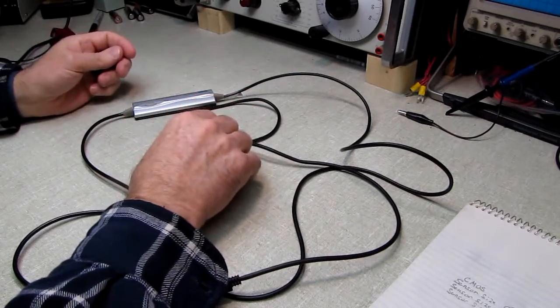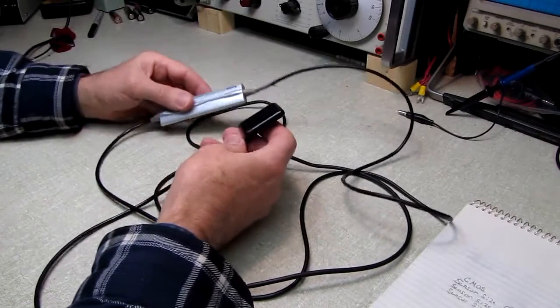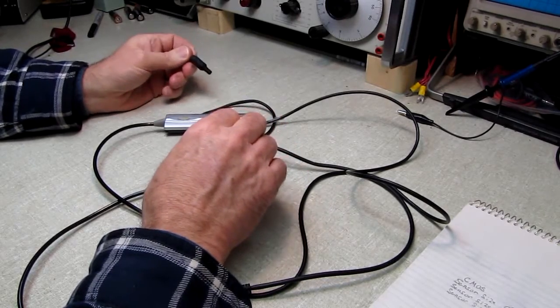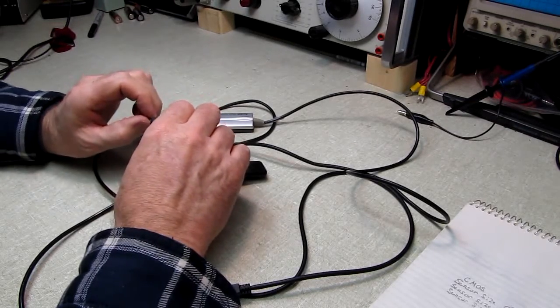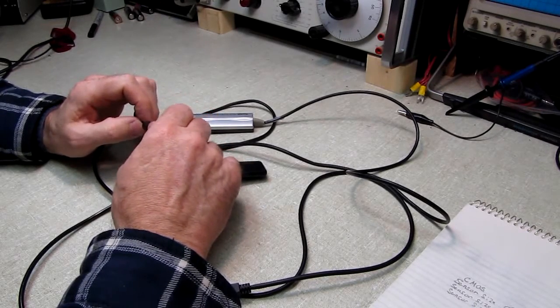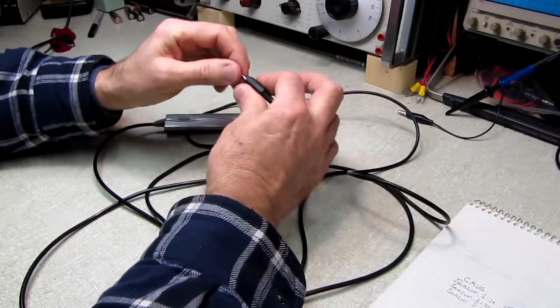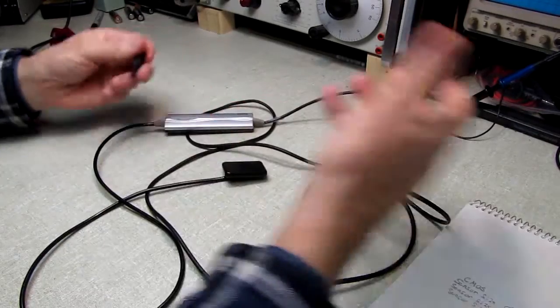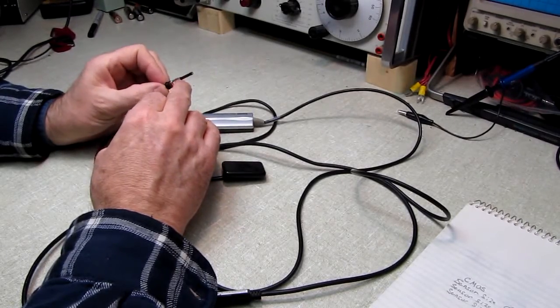At any rate, when she showed up, she dropped off this little unit. Now I should say that Robin works for an oral surgeon, and she has been bringing home for quite a while the electronic stethoscopes that the surgeon uses. Of course, it's a surgery. They have to put people under anesthesia. And the assistants who work there, the young assistants, tend to take these stethoscopes, and when they unplug them, instead of grabbing them by the jack, and this is actually one of the jacks, it's a little cheap plastic jack, instead of grabbing it by the jack to unplug it, they just yank the cord out. And of course, in very short period of time, the wires become broken.